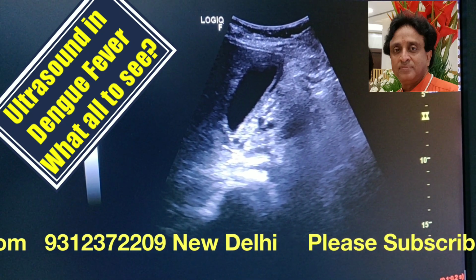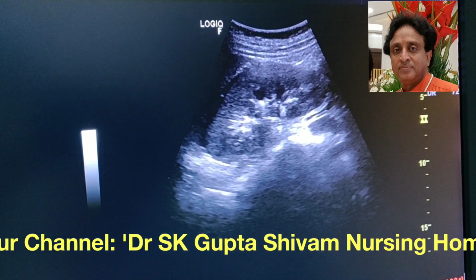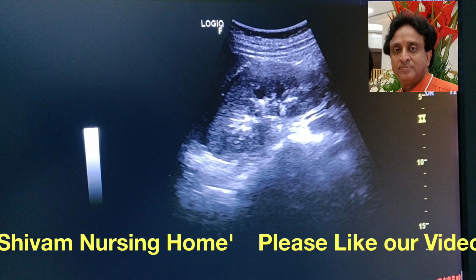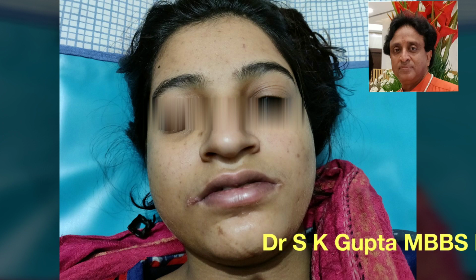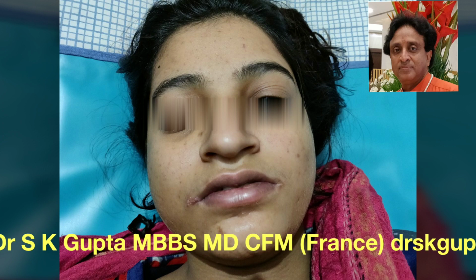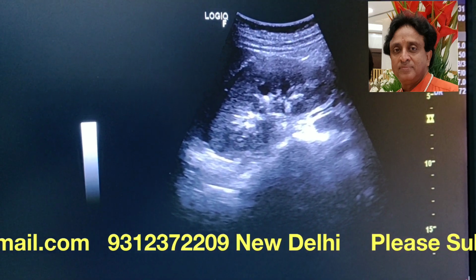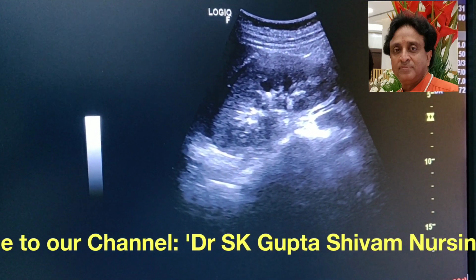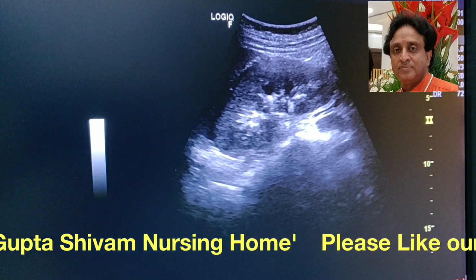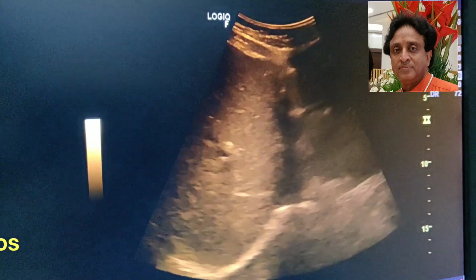She is a 17-year-old girl who has been having repeated vomiting for the last 5 days. She had a small bout of fever about 5 days back, and since then she has been having some rash on the face. You can see her face. The rash is not very conspicuous, but the vomiting is marked and there are no other symptoms. She has been passing very small amount of urine since the last 3 days because of repeated vomiting. Let us do her ultrasound.